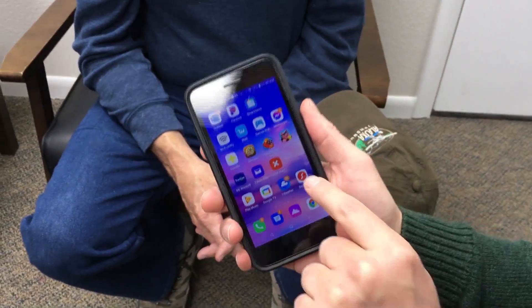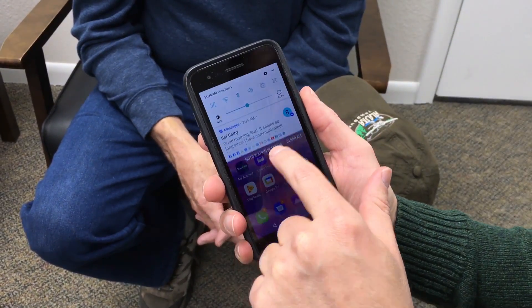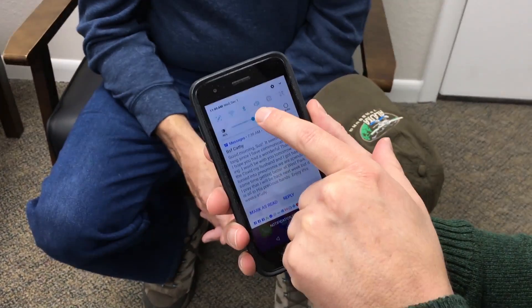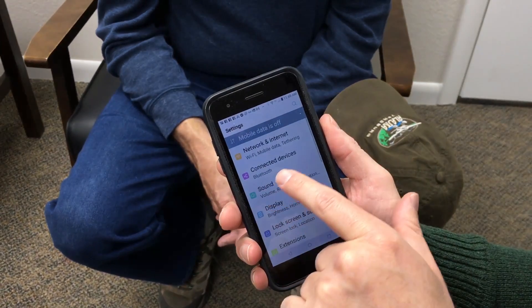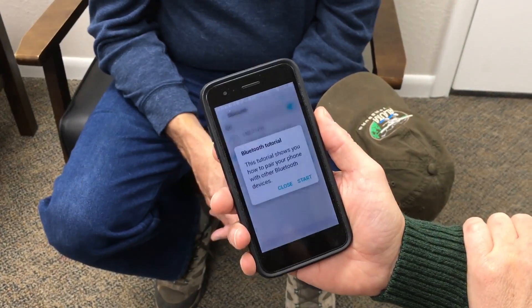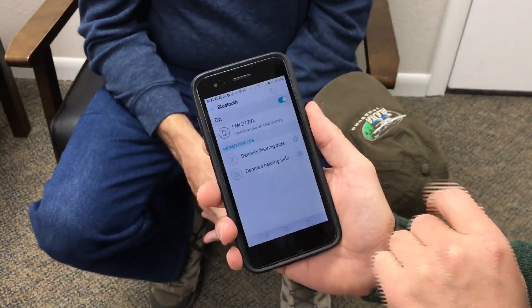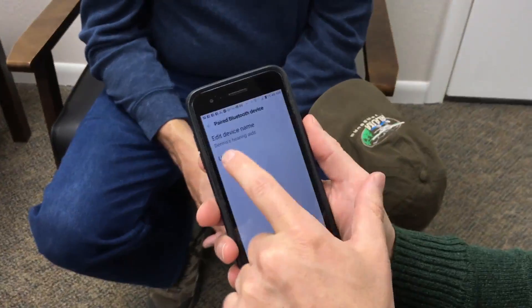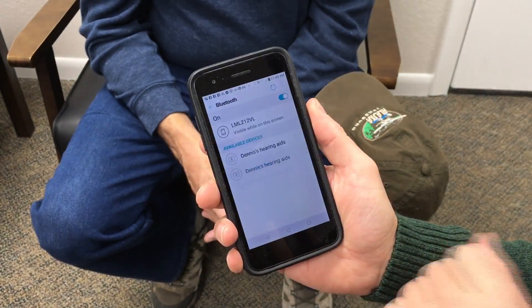I'm going to go back to his main page. The other thing we're going to do is delete his Bluetooth pairing. If I swipe down, I can hit this gear icon, and then go into connected devices. In Bluetooth, we should see Dennis' hearing aids here. I'm going to hit unpair on both of them, which deletes them from the phone.